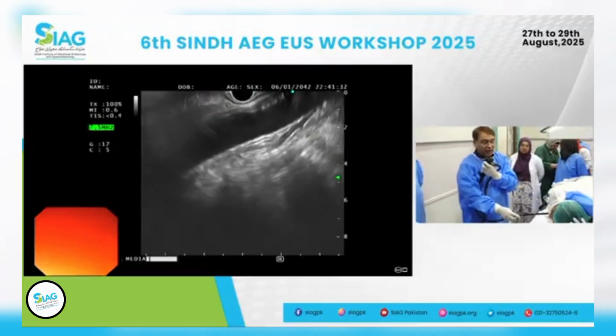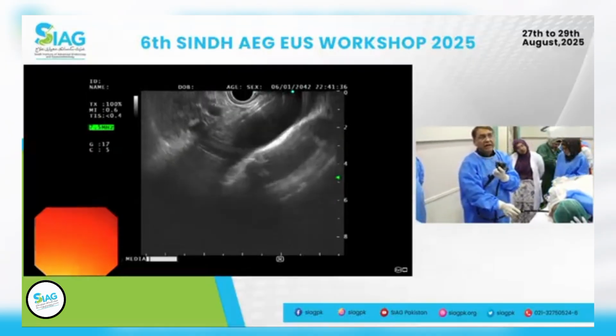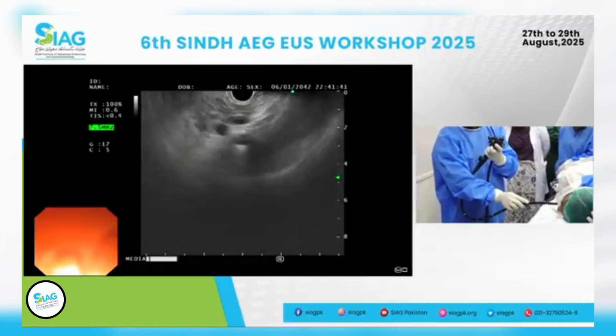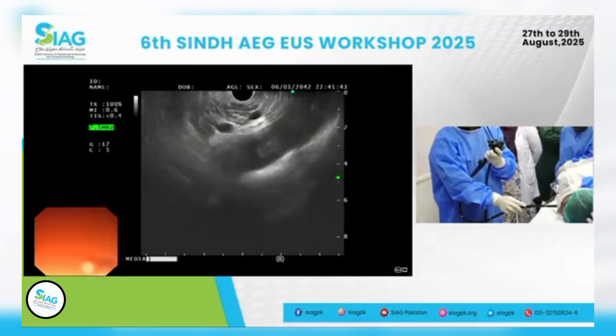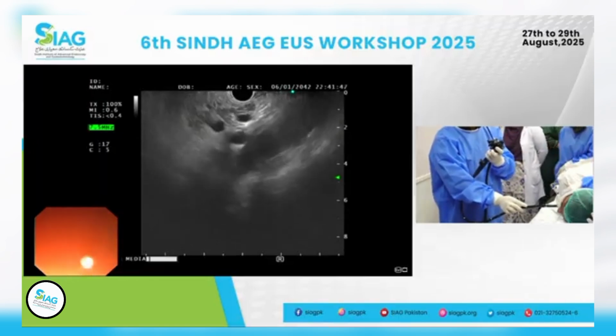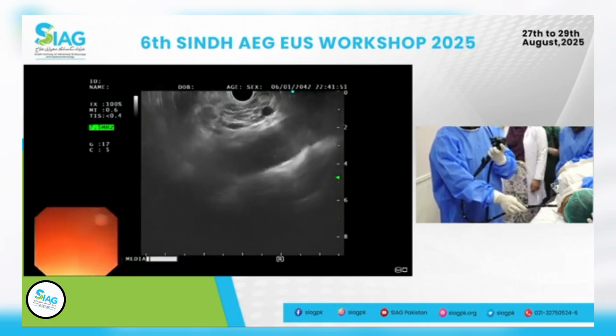So once I have the aorta, I will gently move right and left, keep that aorta in position until I find my celiac. You see that right there is the celiac. Everybody can see that. Salbhai, if you can have a mic and just keep confirming that. Yes, okay, we have very good. Okay, you see the celiac.